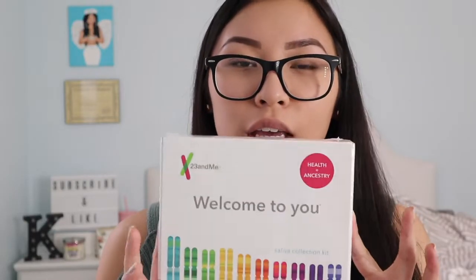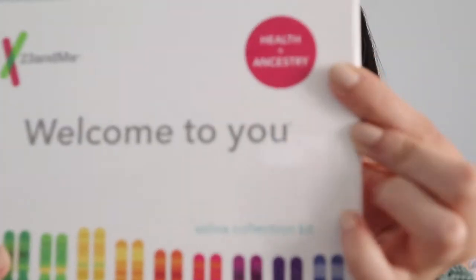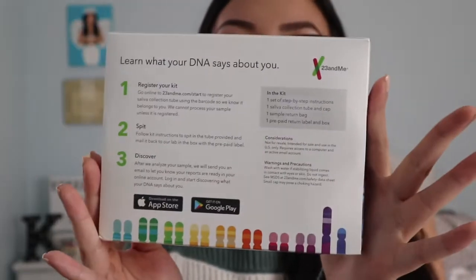Hey guys, today I'm gonna do the ancestry test which is by 23andMe. This tells you about your health and your ancestry — it says right here, it has the instructions on the back. Kind of nervous. This would be a great way for you guys to get to know me, and I'm going to be learning with you guys. They have two boxes: one is just ancestry, and this is the second one which is health and ancestry.